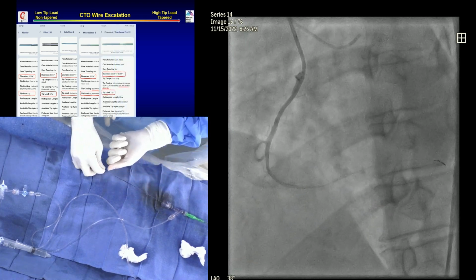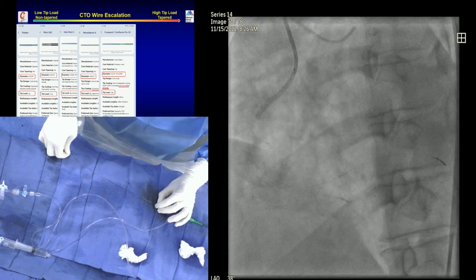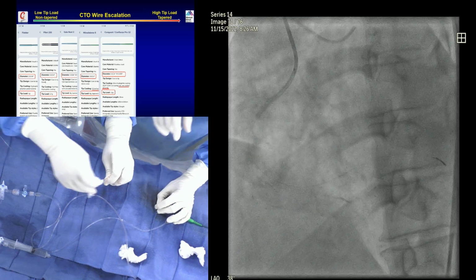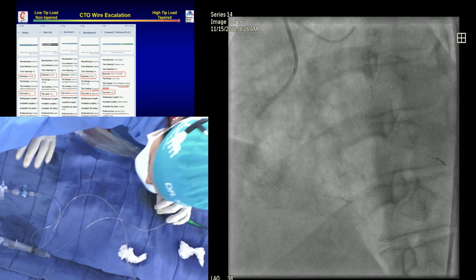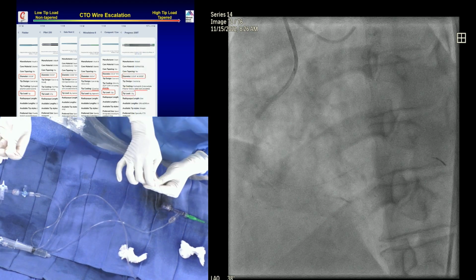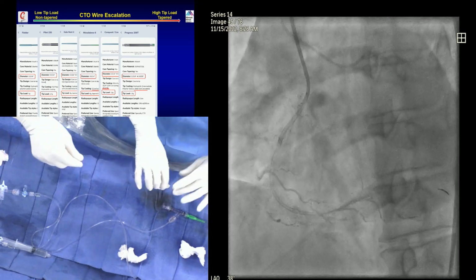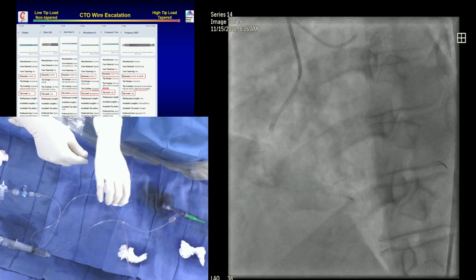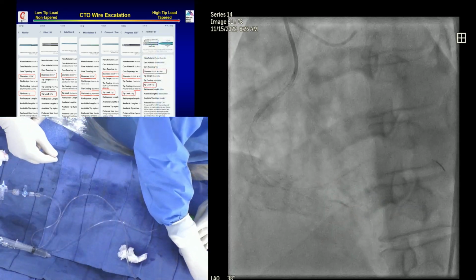So we could have a CTO score of 2. Yeah, good. Now, we have to do a PDA picture. But you have to open the PDA ostium. You see now, get the Fielder wire. See this now, it goes that easy. Because you need to take care of the PDA ostium before you put a stent. There was quite a bit of disease in the AV continuation.